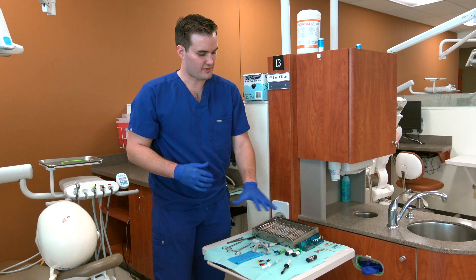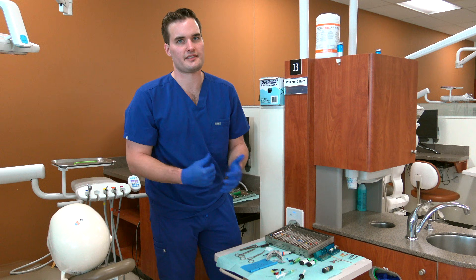So that's everything you guys need — from starting to prepping the tooth, to placing composite, and then polishing it so it's really nice. Keep these materials in mind. Arrive early to set up and you'll be great to go.